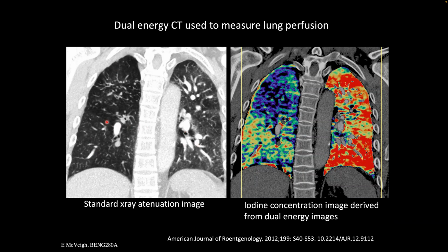That's fine. You can also quantitatively do it by injecting a dye or a contrast agent, and then looking and seeing how the signal in the lung parenchyma changes as a function of time. And in fact, solving for the amount of iodine, the iodine concentration in each square centimeter in that lung. And when you do that, you get a map that looks like this, which pretty well tells you the severity of the drop in perfusion in that part of the lung, right?